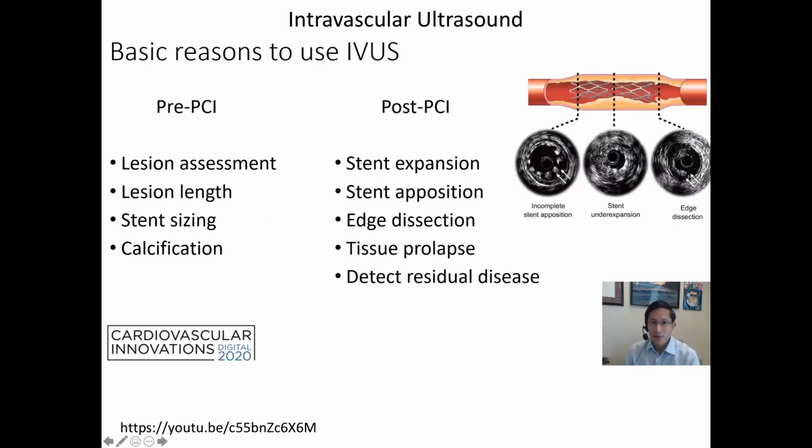And then here, this is a bad outcome, is that in expanding the stent with the balloon, you have caused a dissection in the wall of the vessel, and that is a tear in the intima itself. And so it has come away, right? And is sitting there as a flap of skin, and blood is going in behind it. And that's not good, right? So you probably want to put another stent in and get rid of that, right? And so these are things you can detect post procedure.